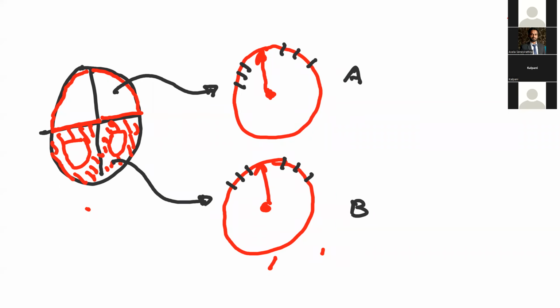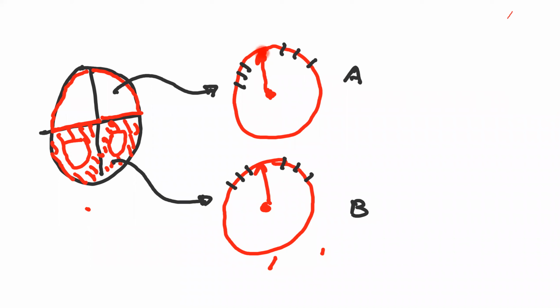ඒ ගැල්වනෝමීටර් එකේ රීඩින් එක අඩුයි. හැබැයි ටයිම් එක ඒක යන ටයිම් එක වැඩි. B එකේ රීඩින් එක වැඩි. හැබැයි යන ටයිම් එක අඩුයි. Right. ඒක අපි මේ galvanometer-ටම දාලා බැලුවොත් if you apply to here, so this is the 0 point.